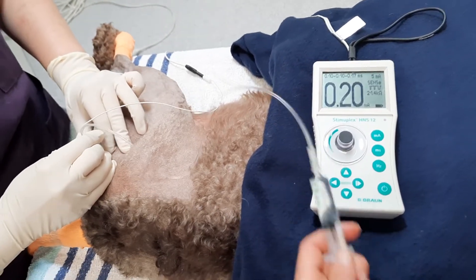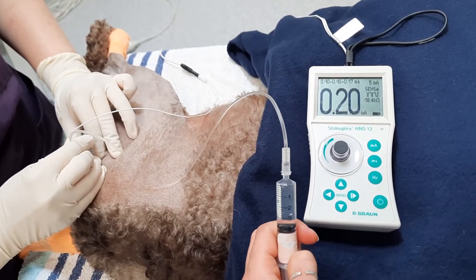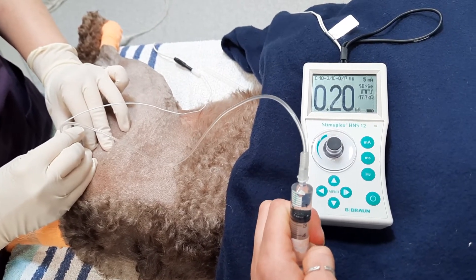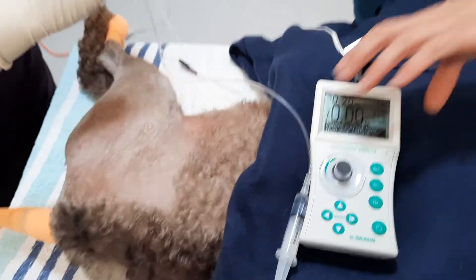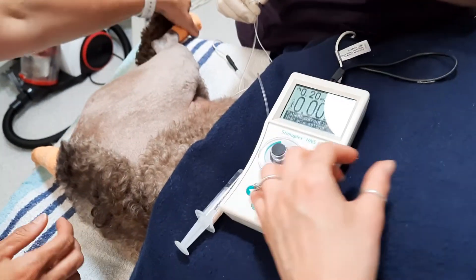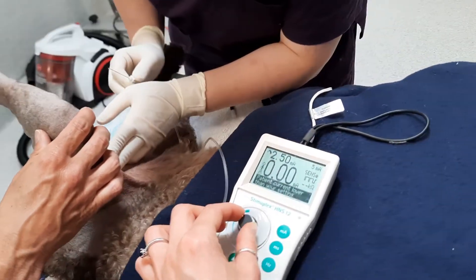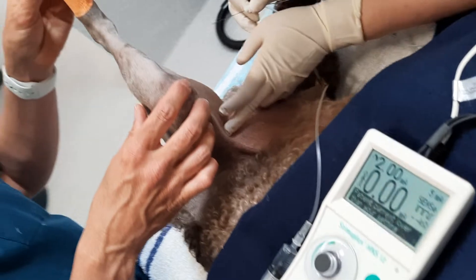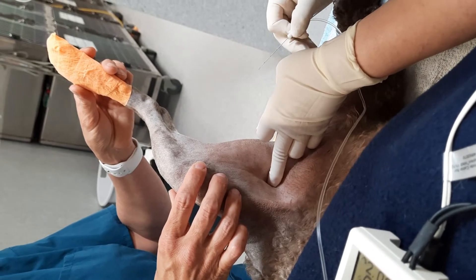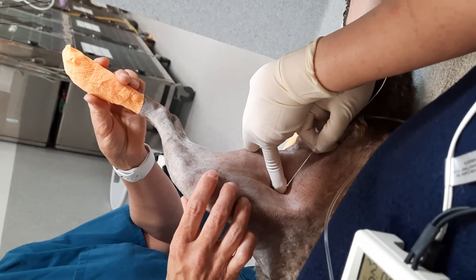We'll draw back and check that we're not in a blood vessel — that's good. So we'll inject half of the local anesthesia. The idea is the same for the femoral nerve block. We'll have our lovely assistant raise the knee and then palpate for the pectineus muscles. The target that we're aiming for is the iliopsoas muscles, and that's where the femoral nerve is within.